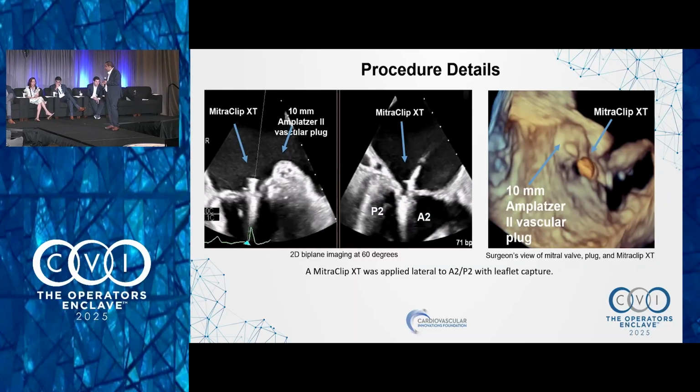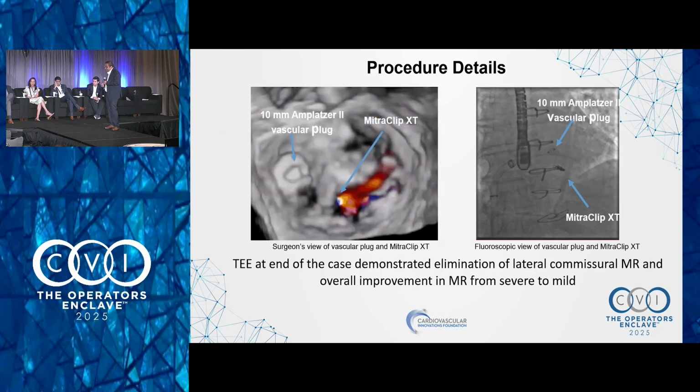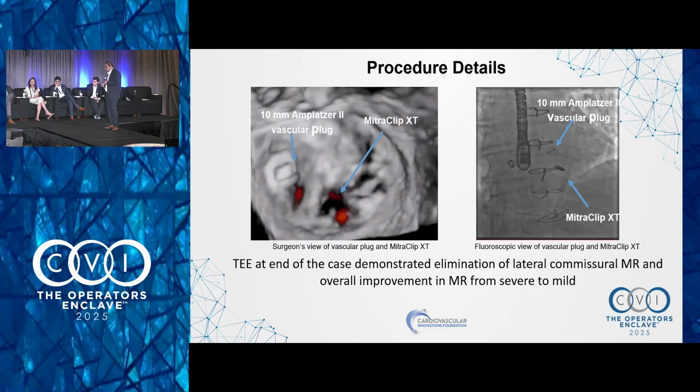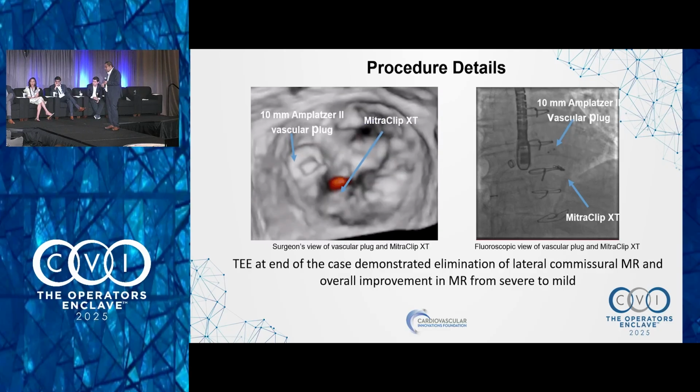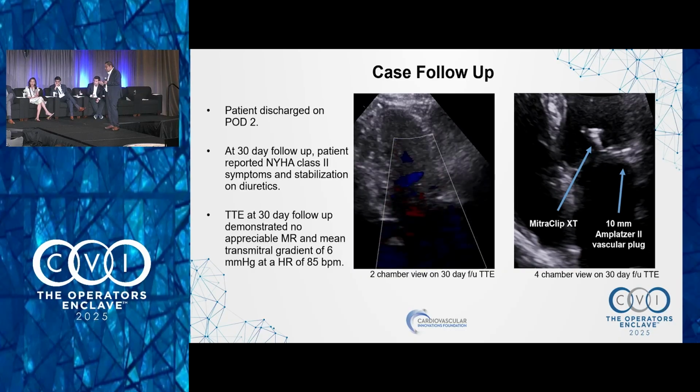Let's see how this goes. In an XT, it looks like, wow. Yeah, go big or go home. And it was a pretty good result actually. And this was the 30-day echo. Patient is doing great and no issues.